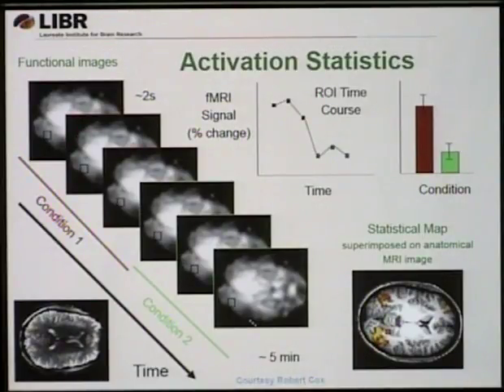They are actually ultra-fast imaging every 2 seconds. But this is also an image which looks like this one, but it's acquired now here, in LIBR. You see how big the difference is? So it's essentially also super fast acquisition, but much higher quality of the image. So technology actually improves quite a bit, but we still need the high resolution structural image acquired independently.